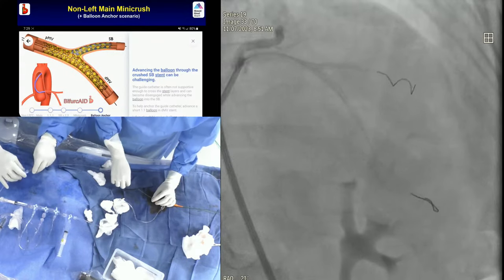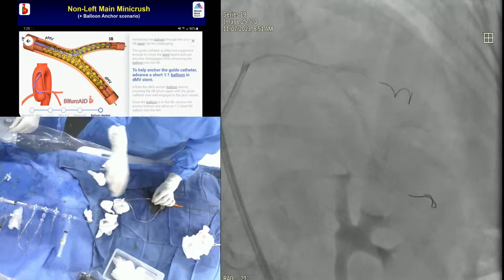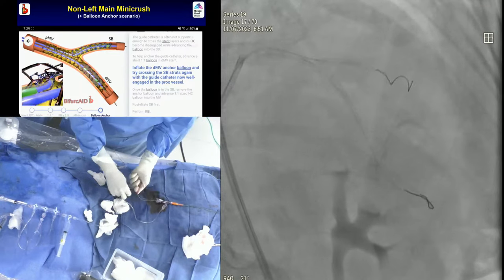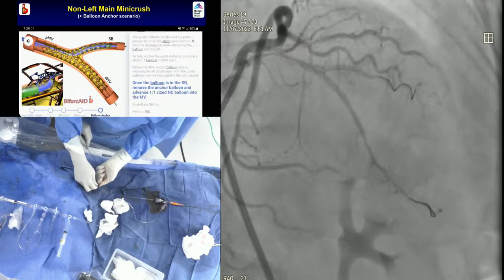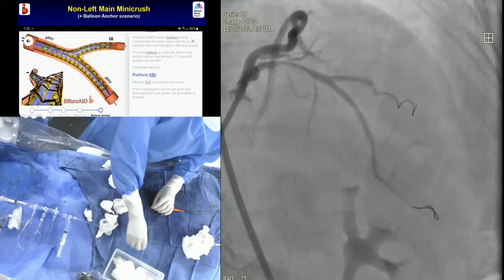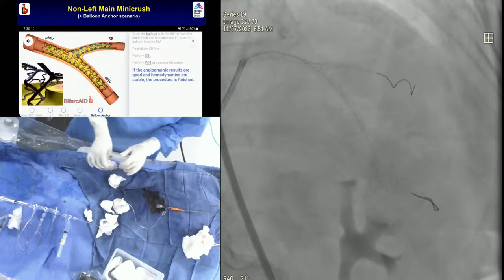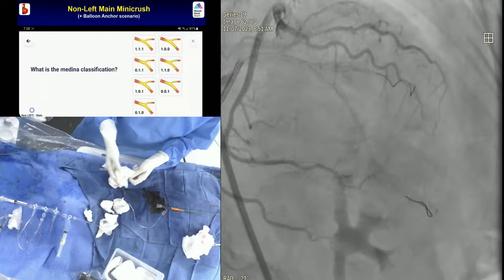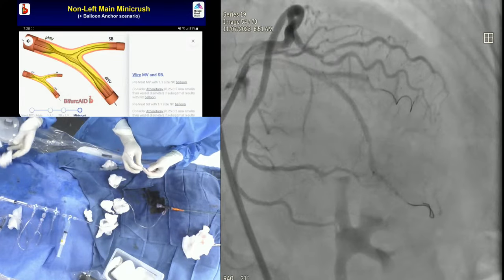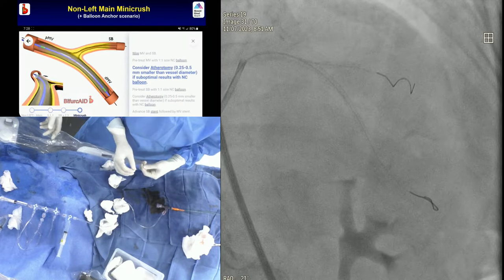Well, the proximal lesion is angiographically looking more and more significant. Ready with the IVUS? Sure. But the purpose of the LAD bifurcation with angulation has been achieved. Now we are going to the proximal, and we decide based on the lumen and degree of calcification. So the side wire has been removed. You saw it before putting a stent in the main vessel. With a mini crush, you had to remove the wire. That's what was done.